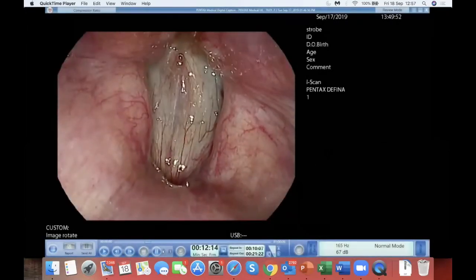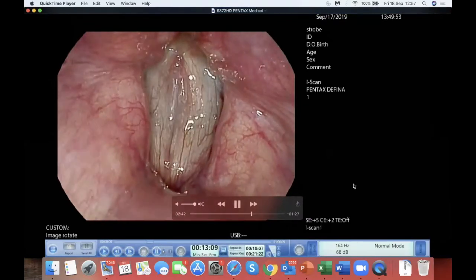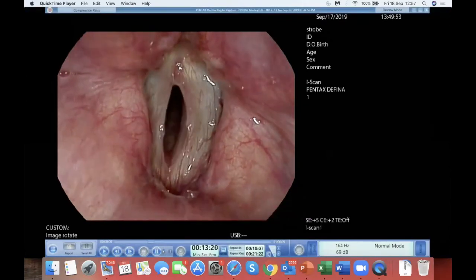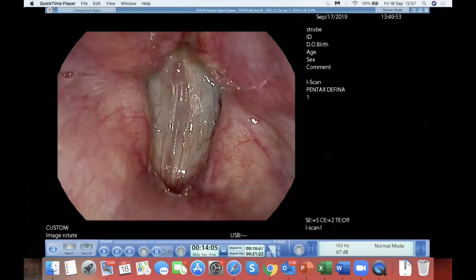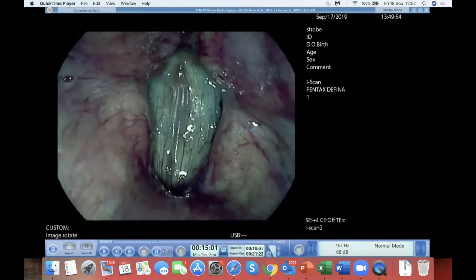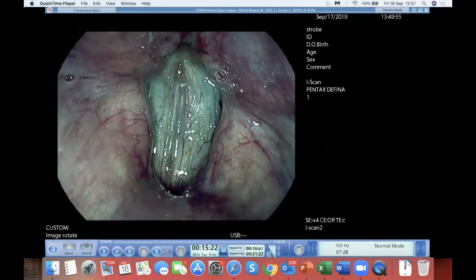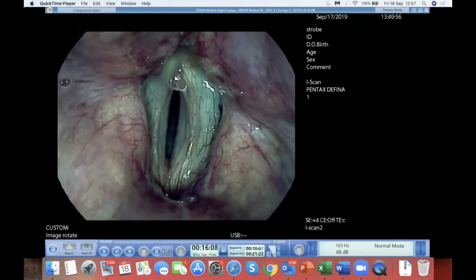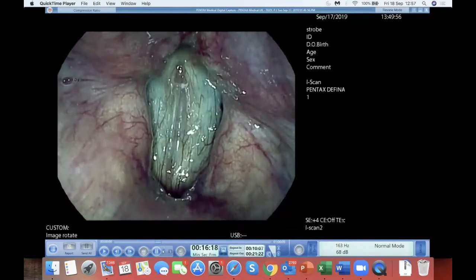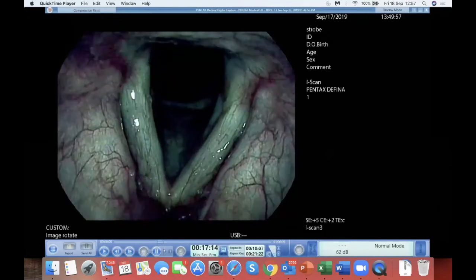What we're hoping to show you in this small sequence is the series of iScan settings. Here's iScan 1, which will hopefully help you to detect any anomalies in the patient. iScan 2 will now identify the extent and the perimeters of that anomaly. And then as it flicks through into iScan 3, this may give you an idea as to the nature of that anomaly.